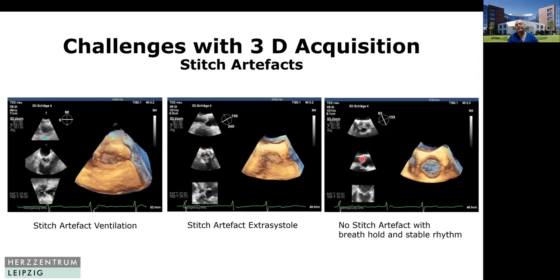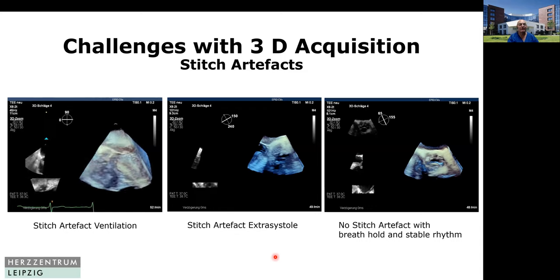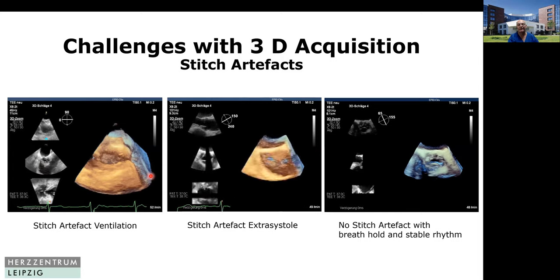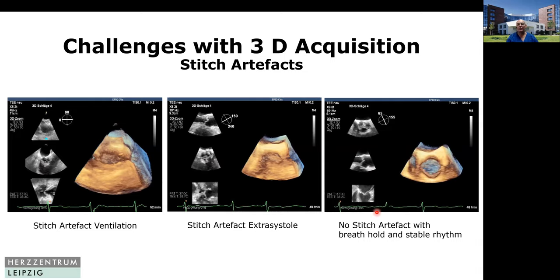This is a perfect four-beat acquisition — you see also in the 2D images there is no interruption in the image. Let me show that comparison: this is the stitch artifact here, this is the stitch artifact, and this is perfect — no stitch artifact because this is recorded with breath hold and the patient has a stable rhythm.